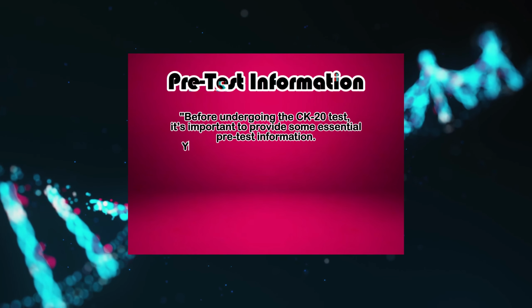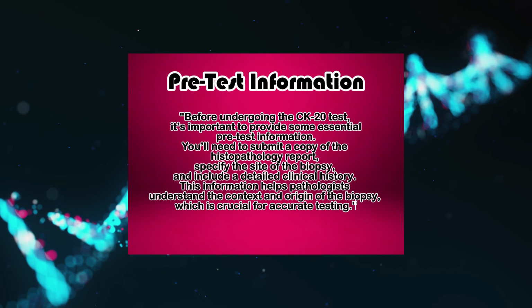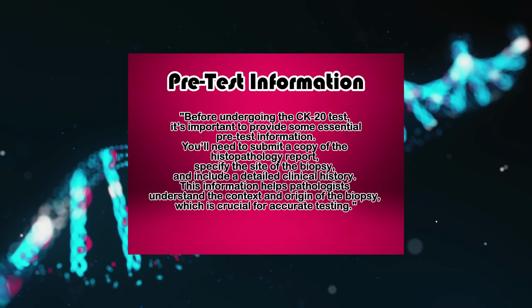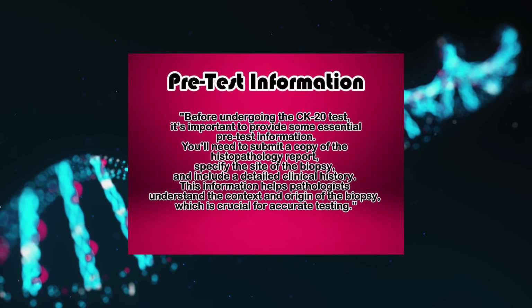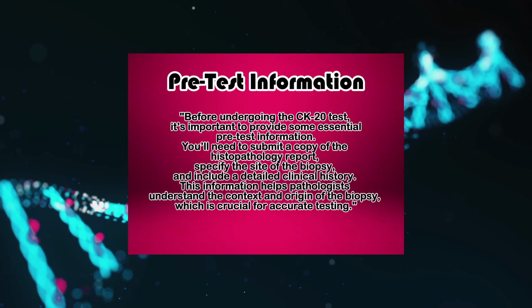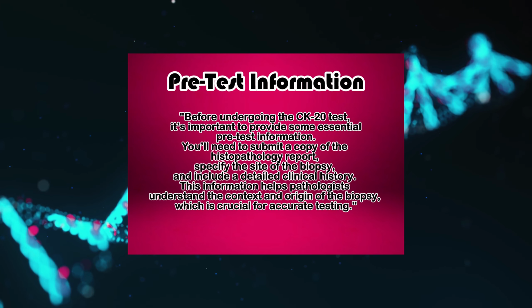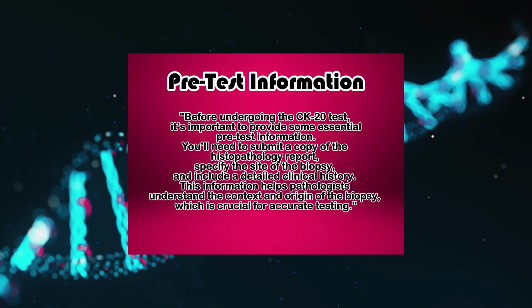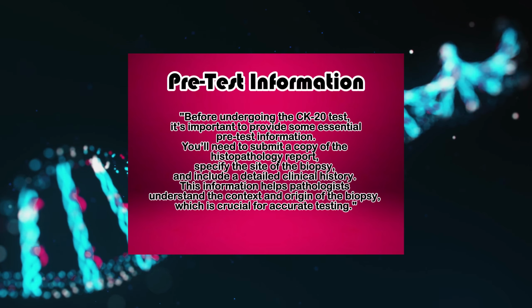Before undergoing the CK-20 test, it's important to provide some essential pre-test information. You'll need to submit a copy of the histopathology report, specify the site of the biopsy, and include a detailed clinical history. This information helps pathologists understand the context and origin of the biopsy, which is crucial for accurate testing.